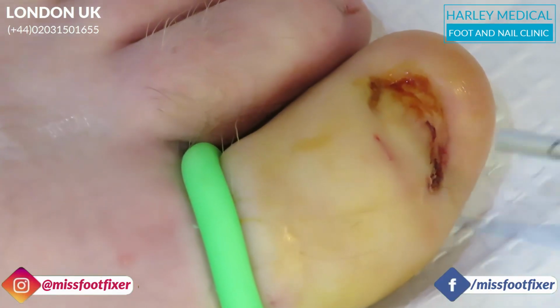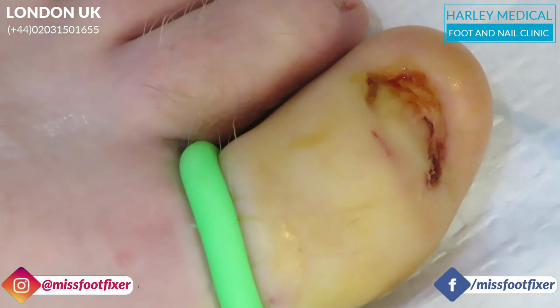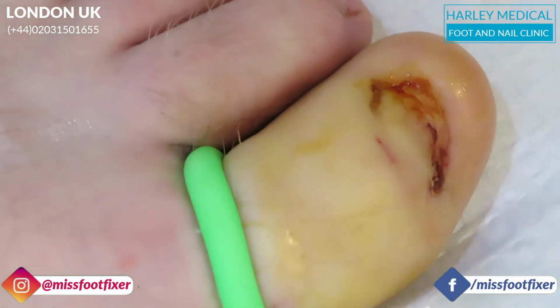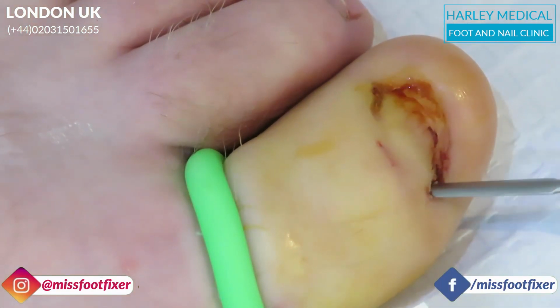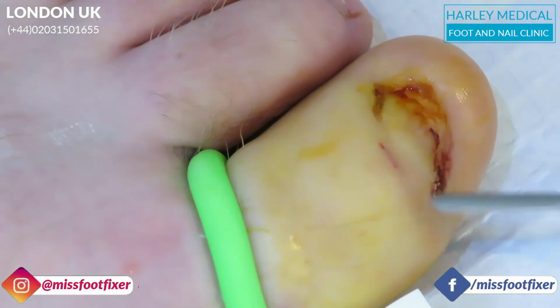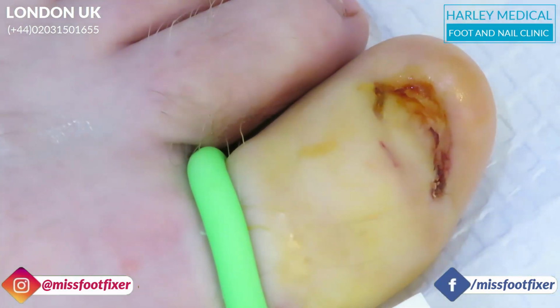Quite painful. And when you came in, what day did you come in? 16th October. Yeah, a couple of days ago. And it was like really red and swollen. It was just bad. So we're giving him some antibiotics, and it's actually cleaned up really, really good. And so what we're going to do is we're going to remove these bits here, clean it all up, and then we're going to use a chemical called phenol just to kill off the remaining bit of tissue that's inside the toe. Okay, we've anesthetized this, so it's going to be fine. Hopefully we'll never go back out again.